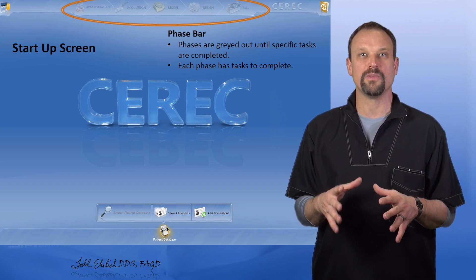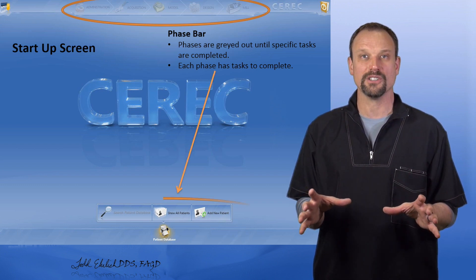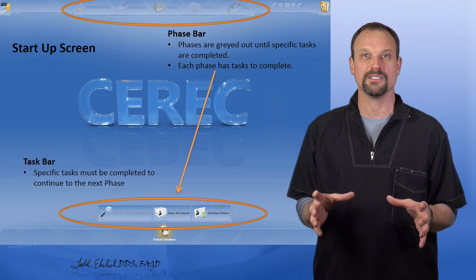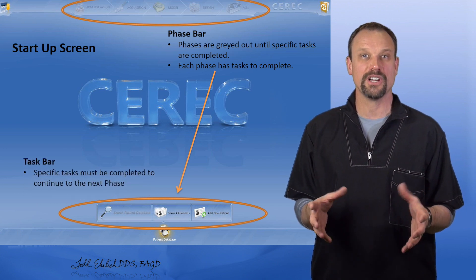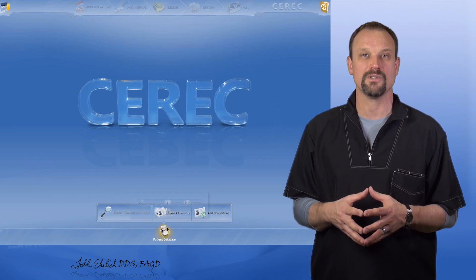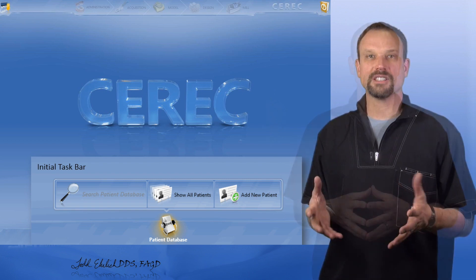When you go down to the bottom where that task bar is for this particular phase, in the administration phase in this example, we have a few things that we needed to do.